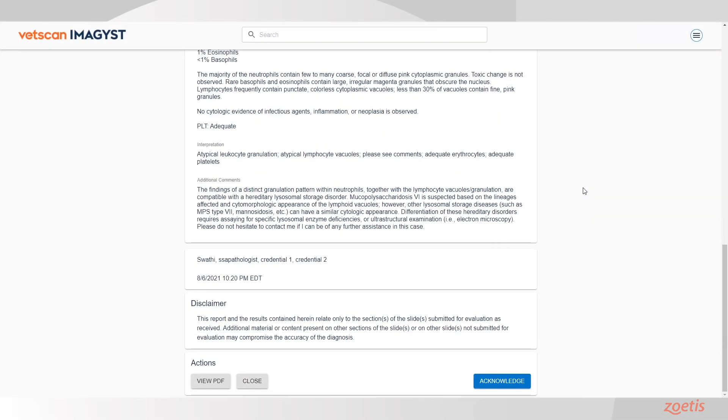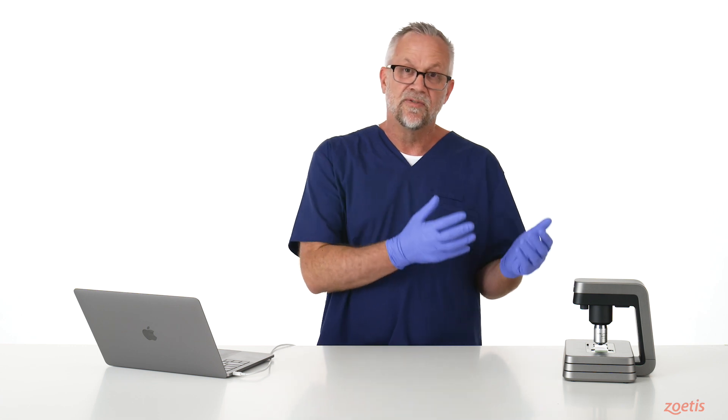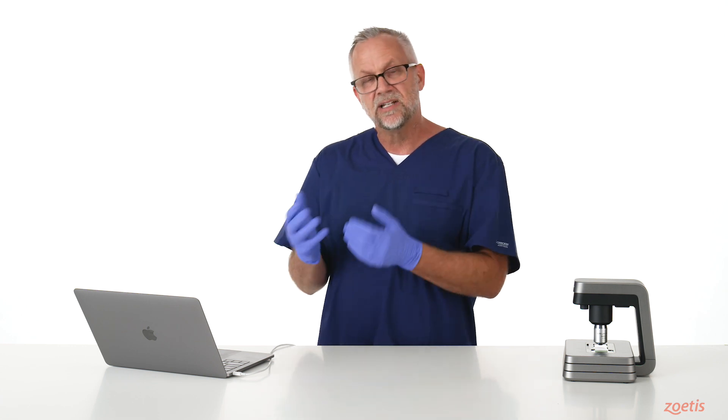And if you scroll to the bottom of the screen, you can acknowledge the report. This indicates that you have seen the report and it will move it from the Ready to Review tab to the Test History tab.